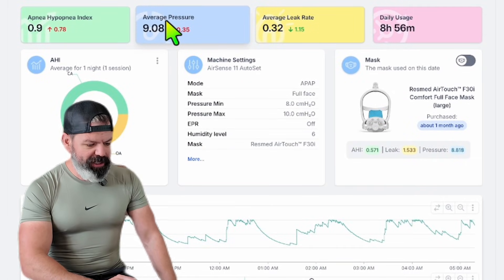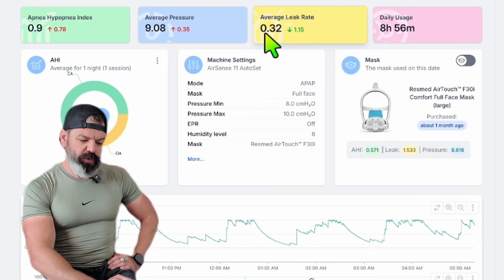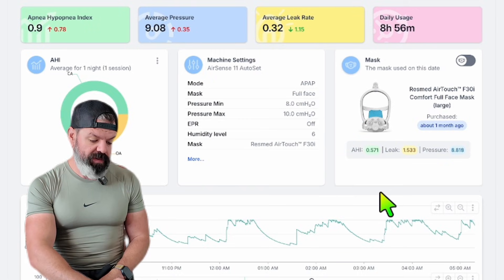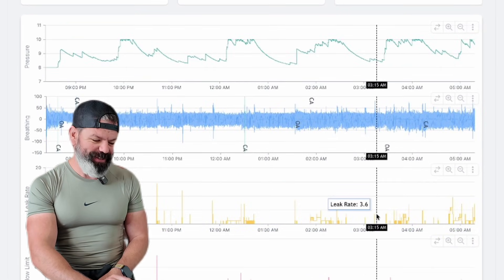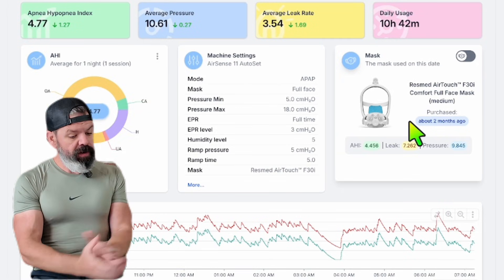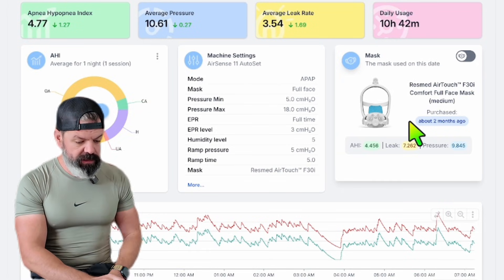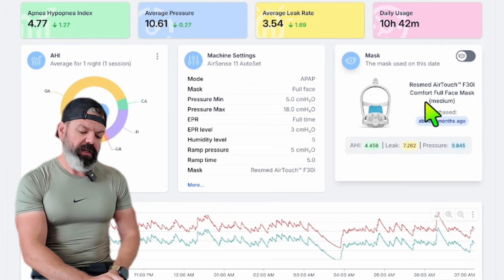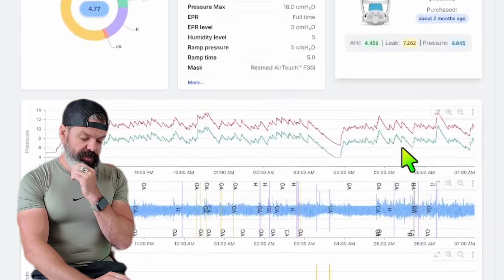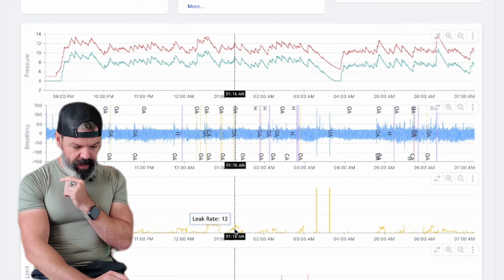Next up we have Hamish — average pressure of nine, average leak 0.32, and leak throughout all these nights 1.53. We're giving him an A+. Well done, buddy. Next up, Jay — average pressure of 10.5, average leak 3.5 on this particular night. However, when he's using his AirTouch, his average leak across all nights is 7.2. On this particular night, we are giving him a B.